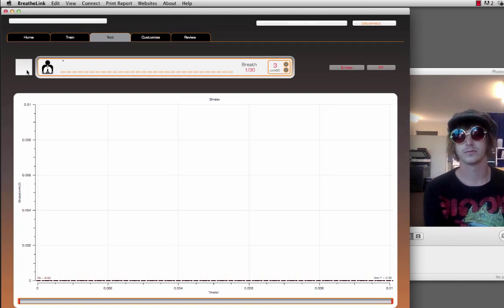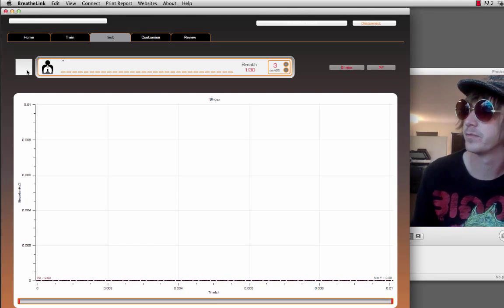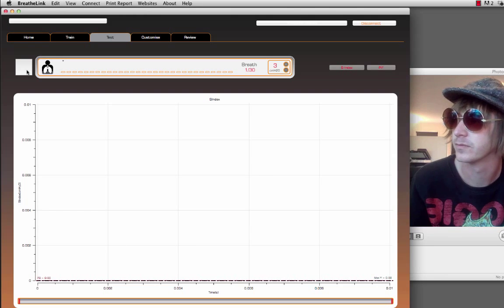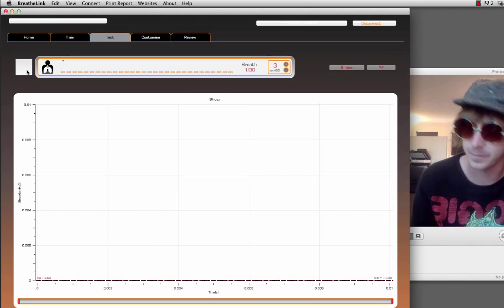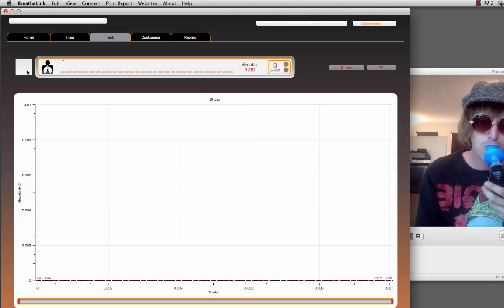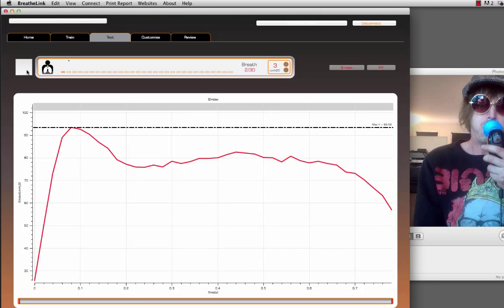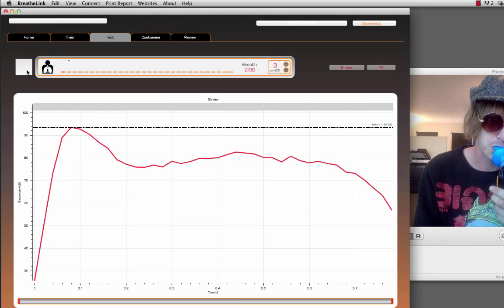Cool. So grab that guy. Breathe out through the device. All air out of your lungs, and then hit it hard. So again, okay, however you want to do it, whenever you're ready. Nice start. Good. Just stop there for a sec.